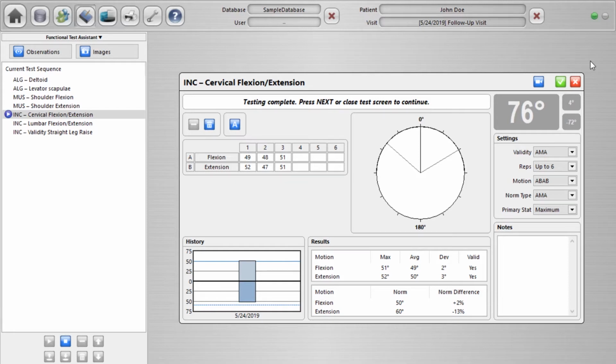So by capturing specific data points, in the case of the North Star software in particular, it's not only capturing those data points, not only seeing those component values, which can be reported, by the way, but also, during the course of the evaluation, having a good sense of whether you met a particular requirement for being able to show consistency of effort. So let's take a look at some of the values that we got here.